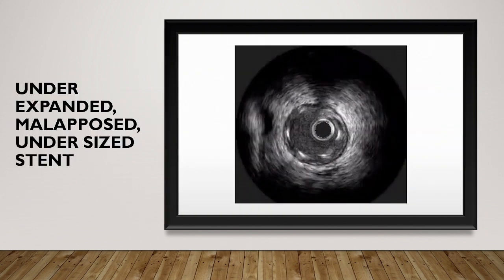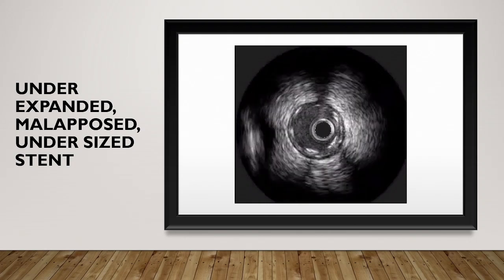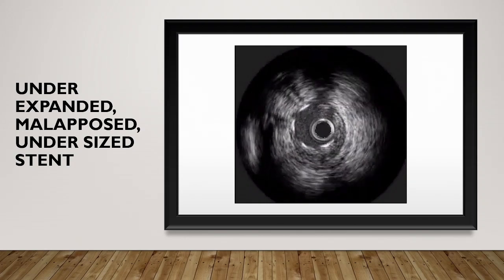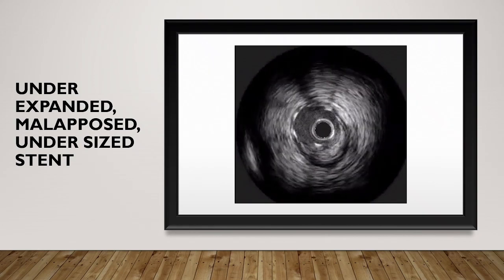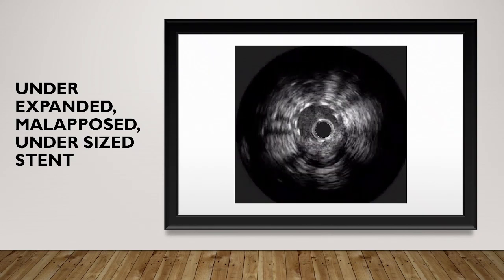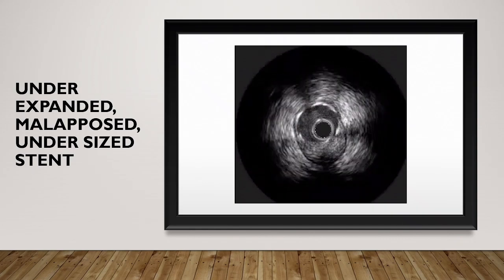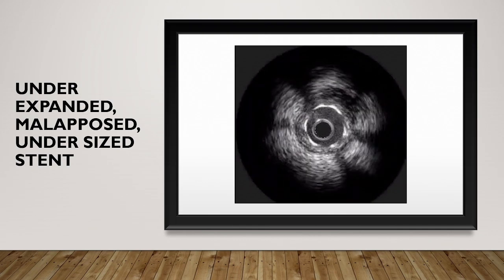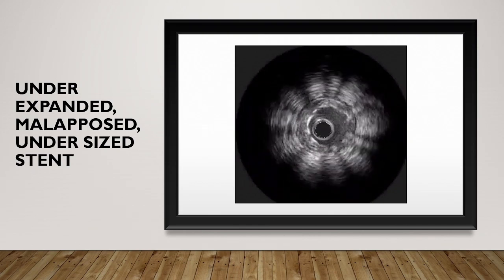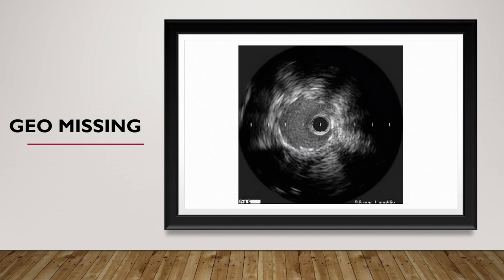This is an under-expanded, malapposed stent. You can see under-expansion, malapposed struts and an undersized stent for the vessel. Look at the stent size and the vessel size. That's where the role of imaging comes in. You are angiographically getting a very good luminogram of a 2.5 millimeter vessel, but this vessel is more than 3.5 millimeter. If such an under-expanded stent is left, then these vessels are prone to a second procedure.